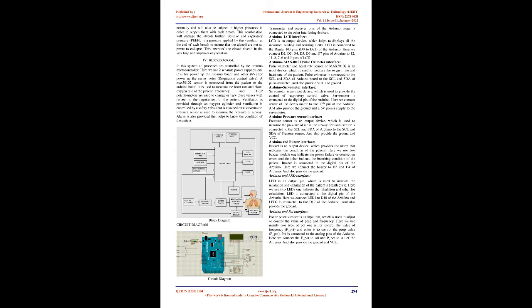Tidal volume. Tidal volume is the air volume entering and exiting the lungs each breath, or tidal volume is the amount of air that moves in or out of the lungs with each respiratory cycle. Excessive volumes can overinflate and stretch lung tissue, causing injury. It is therefore chosen by the clinician, usually using predicted body weight. It measures around 400 ml in a healthy female.